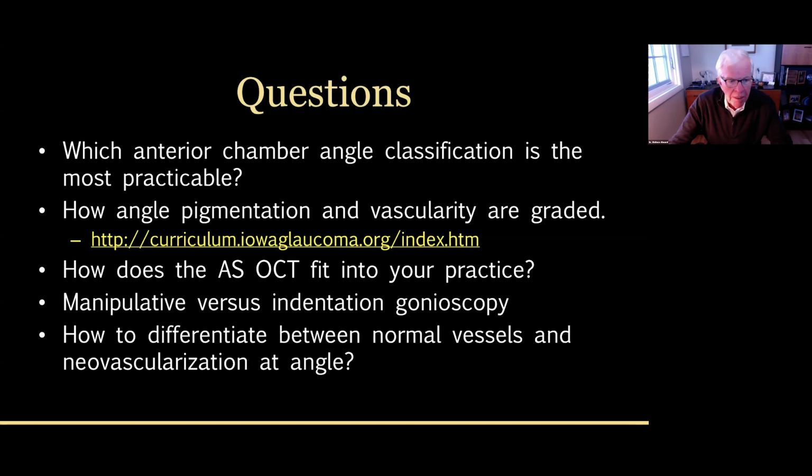Someone asked about manipulative versus indentation. In my mind, those are the same thing: dynamic manipulative indentation. And we talked about how you differentiate normal vessels. Those are usually circumferential. Neovascular vessels typically cross the scleral spur and branch, as we saw in that really great example at the beginning.